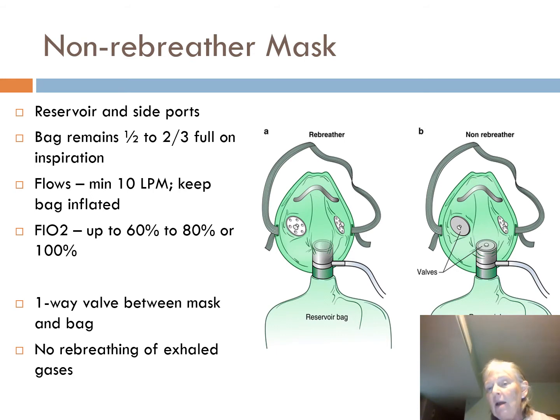Now, a troubleshooting point is this. If you're looking and the patient looks good, but not quite where you think they should be with this non-rebreather, go ahead and look at that little valve. If that valve is not moving, then there's a possibility it's stuck. Take your gloved hand. You can just move it up just a little bit, see if it'll loosen it up. And if it does and starts moving, and like I said, not much, just a very, very small amount, then you know that was stuck at that particular point in time.